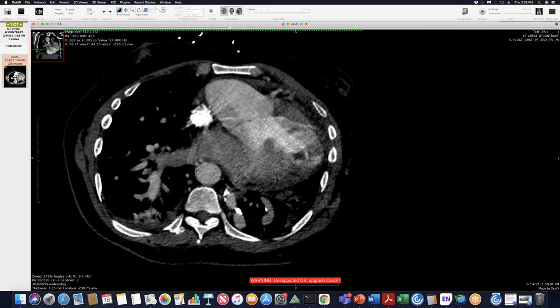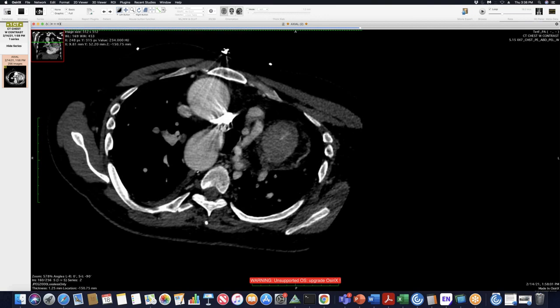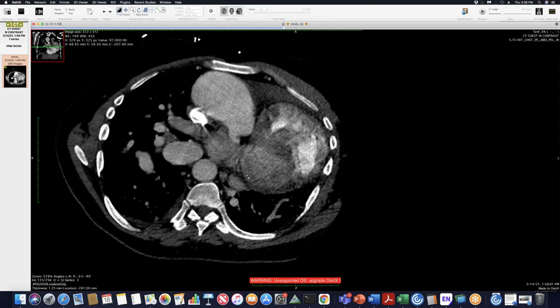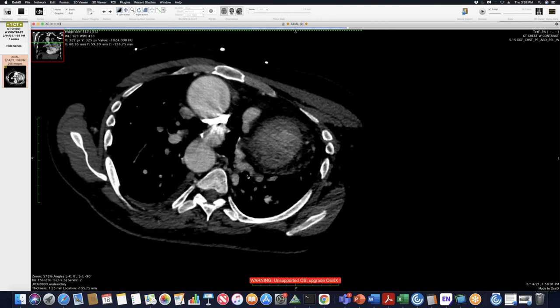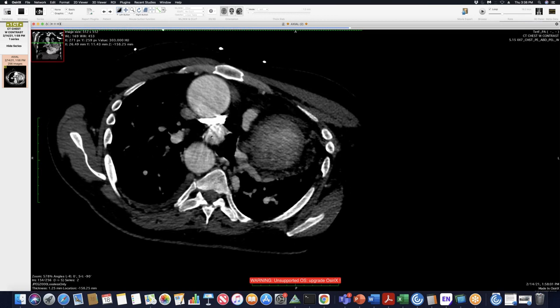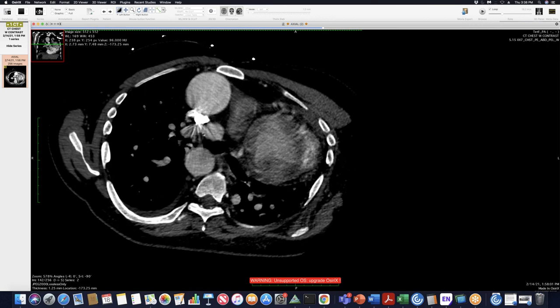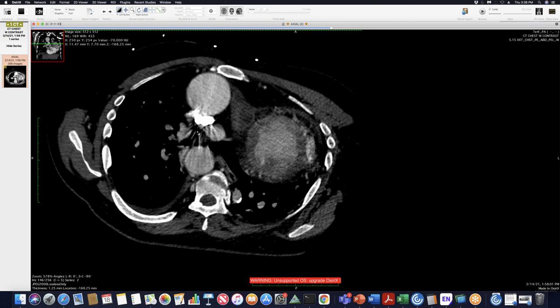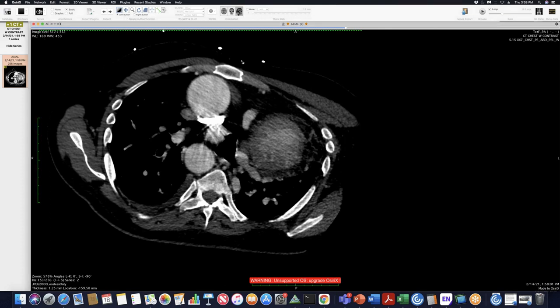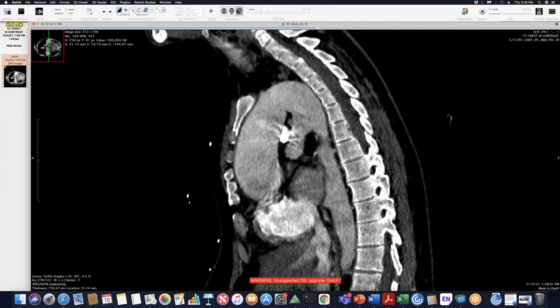Interestingly, he has developed all these MAPCAs which are supplying the pulmonary circulation — all these circuitous vessels coming off the aorta into the pulmonary vessels on both sides. One structure I wasn't completely sure about — I'm not sure if this is a very large PDA or just another MAPCA. If this is a PDA, that would have allowed development of the right pulmonary artery from blood supply through the PDA. But it looks like another MAPCA. It's not in the right position for the PDA. And you also have the bonus of the retroaortic brachiocephalic vein going behind the ascending aorta.